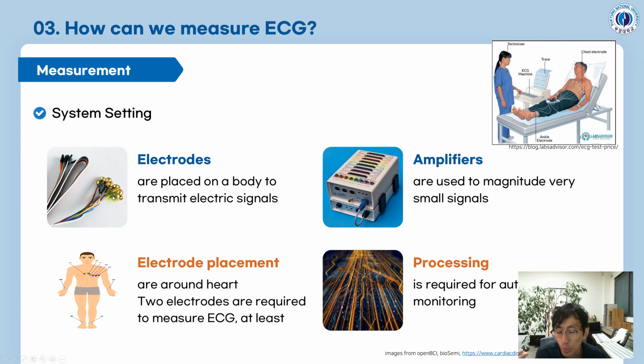Because we want to get the electric signal from our body, the electric signal should be transmitted without noise.